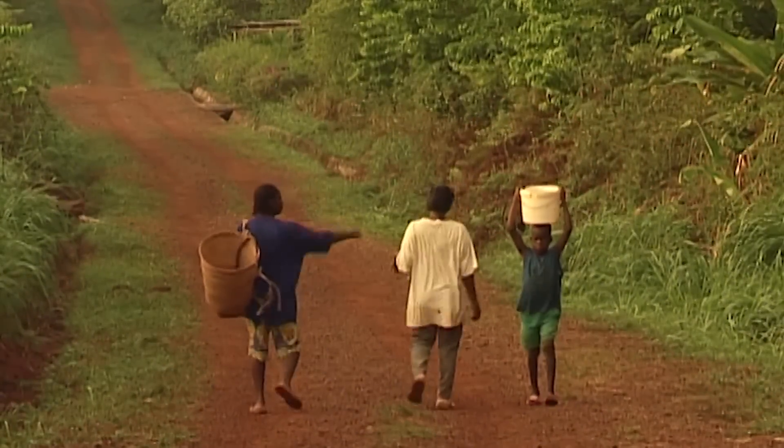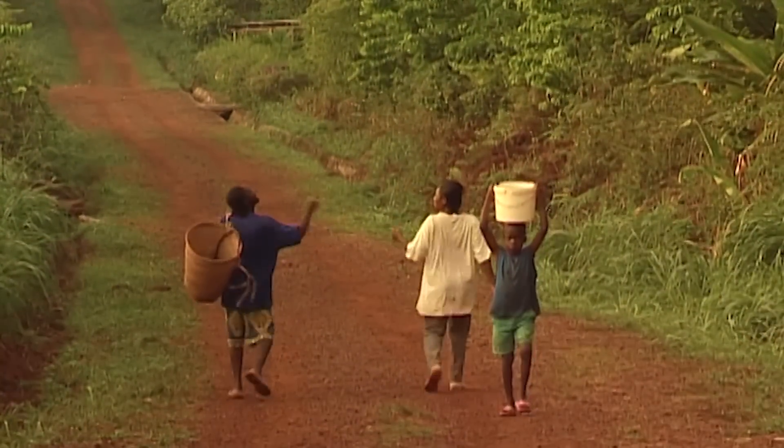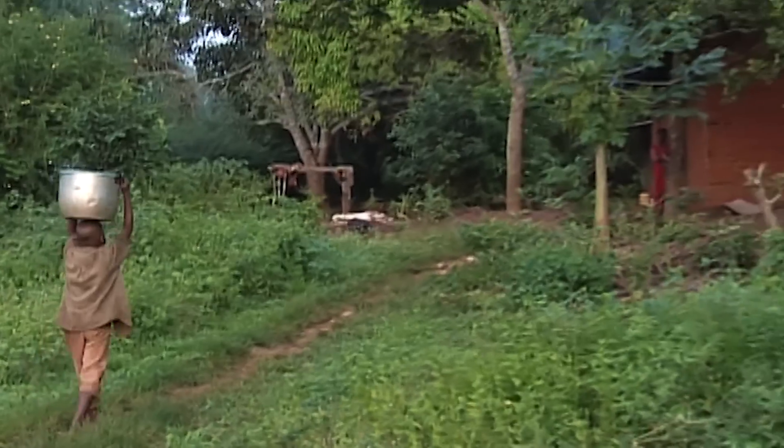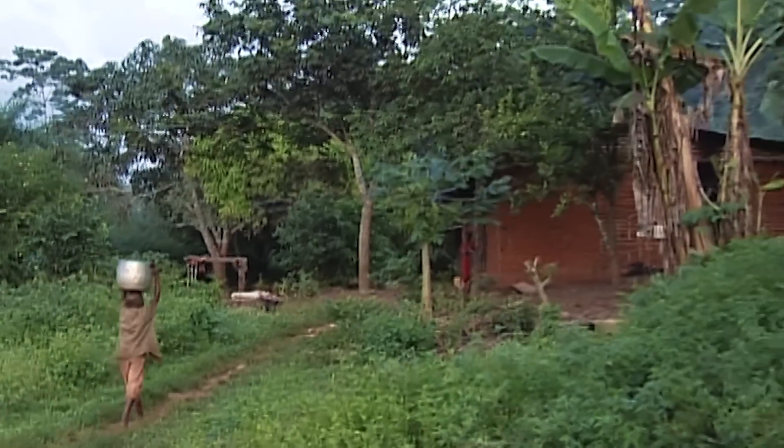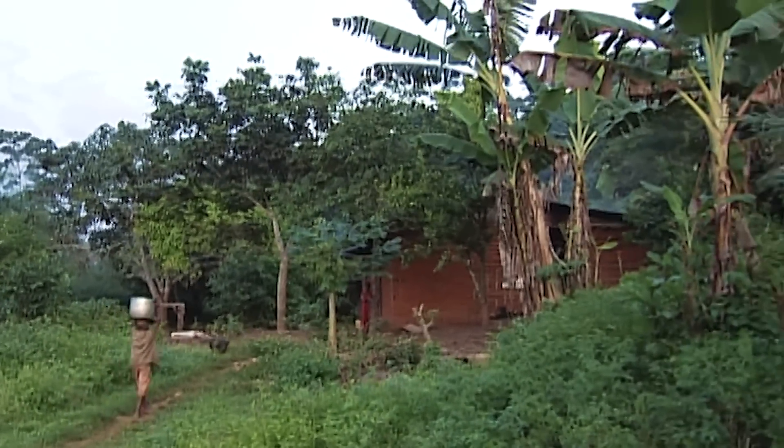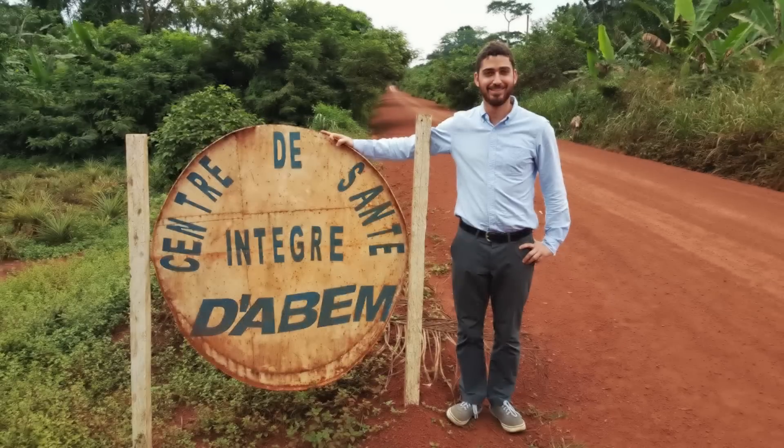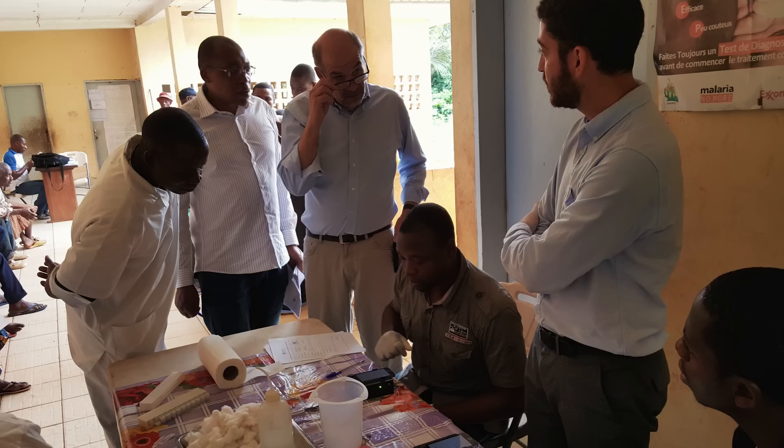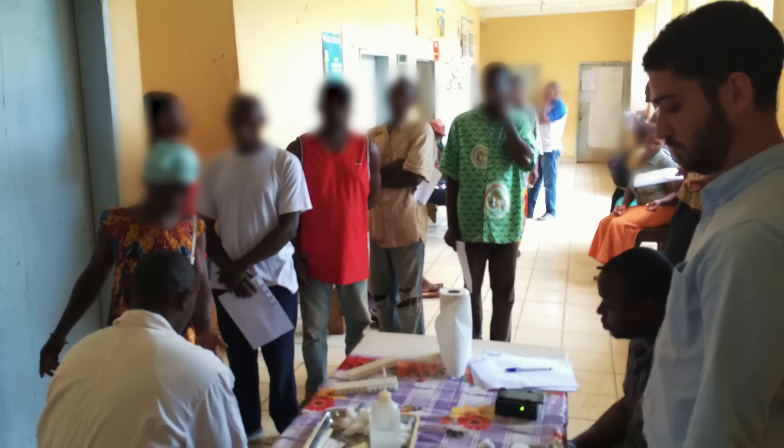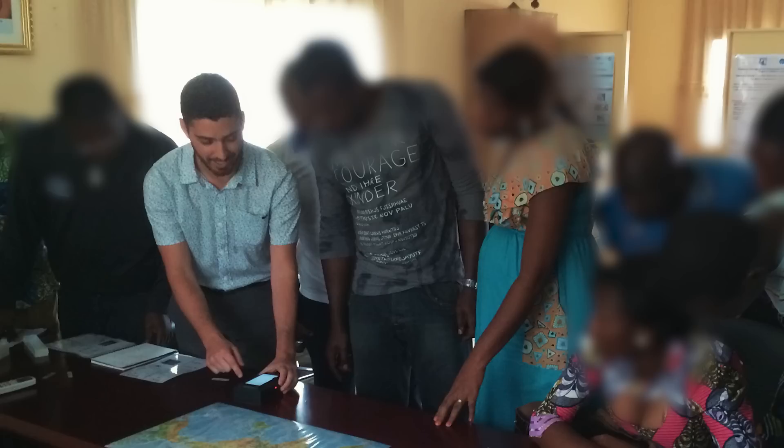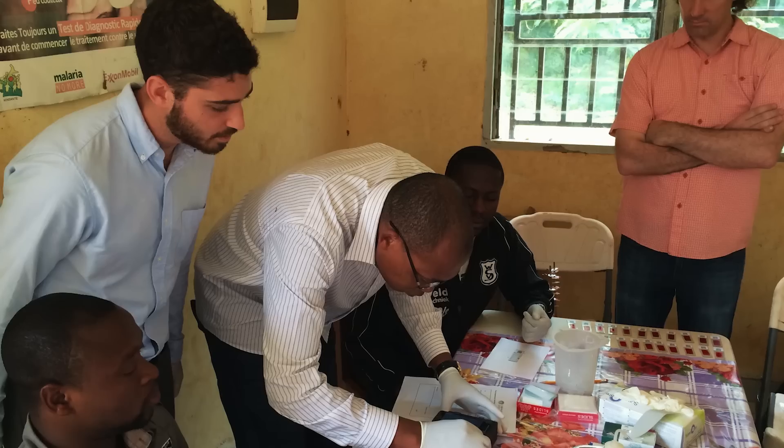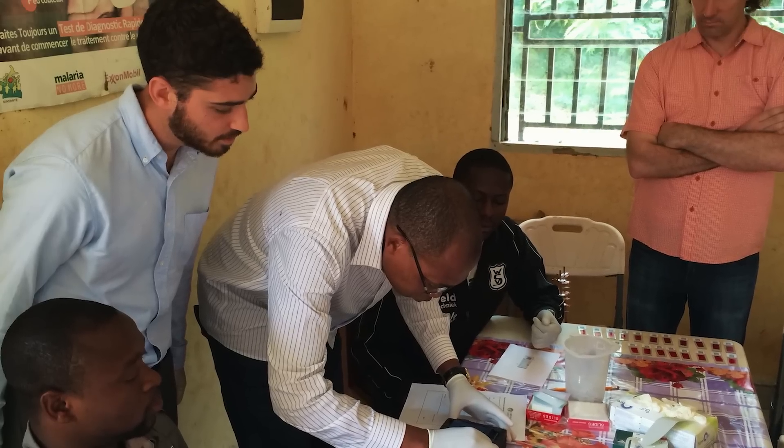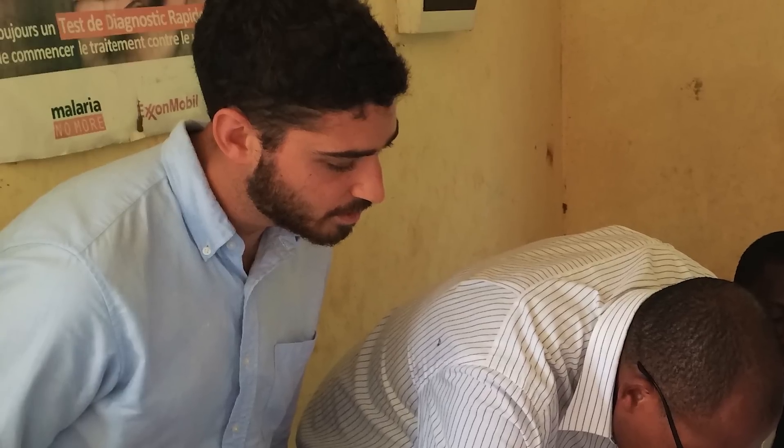And the team has been fortunate enough to see firsthand the impact the CellScope has had in Cameroon, where for many, the cost of seeing a doctor in a hospital is simply out of reach. So I was very nervous in the beginning, and then you start to see the first few patients running through, getting their results, and really smiling and being happy about it. I think the fact that they were included in the diagnosis really makes a difference. So rather than taking some blood and sending it off to a lab, you really feel like you're there doing something that's worthwhile, spending your time making a difference.